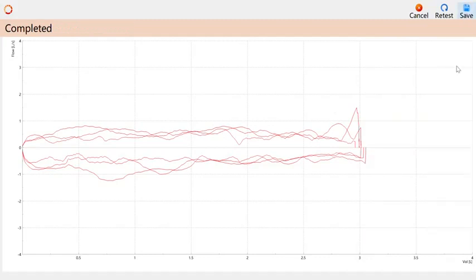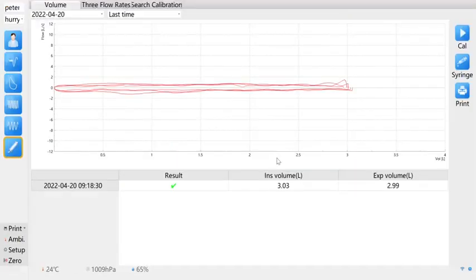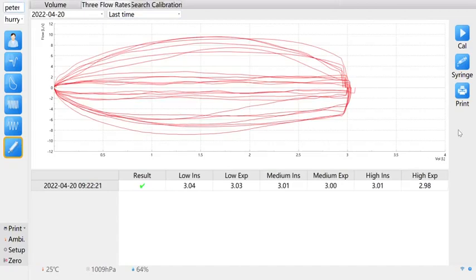Click Save to view the calibration results. A green tick indicates that the calibration is passed. If the result is a red cross, it indicates that the calibration is failed and needs to be recalibrated. The judgment standard is whether the inspiratory volume and expiratory volume are within plus or minus 2.5% of 3.